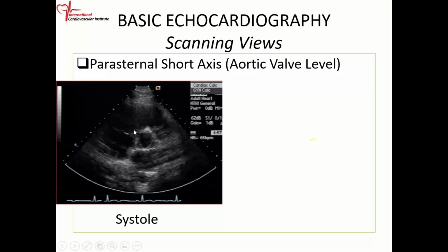So this is the aorta. This marker represents the transducer. So the computer gives you the position of the transducer, and it's right there.